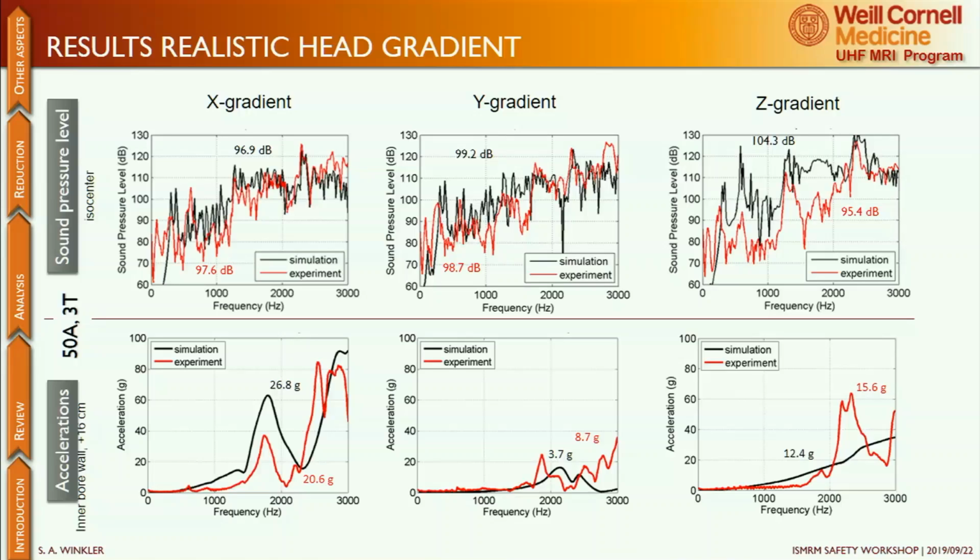It's not really reflecting that the body gradient is louder, but the body gradient had acoustic absorbent material that we can't take out because it's built in. So, take it with a grain of salt, but I wanted to show the measurements still.